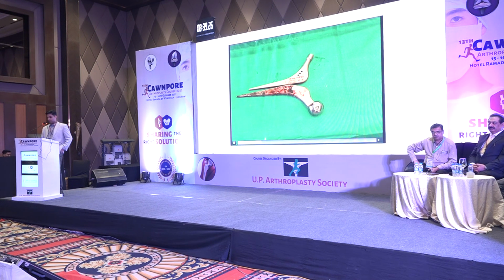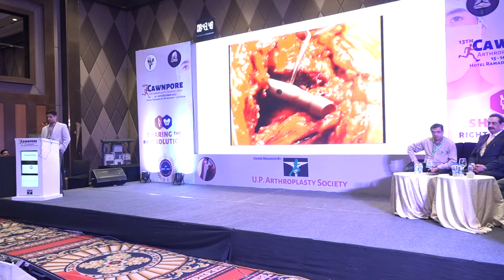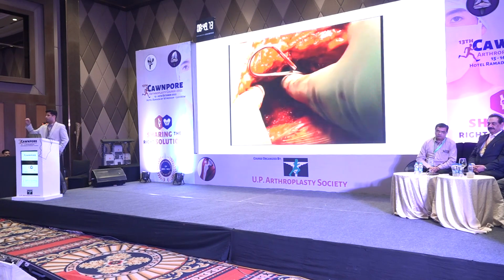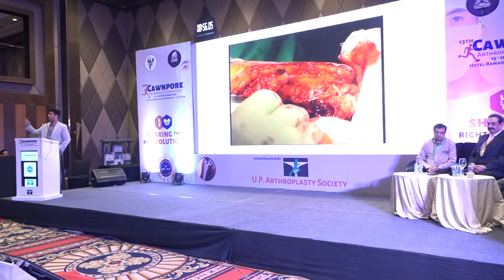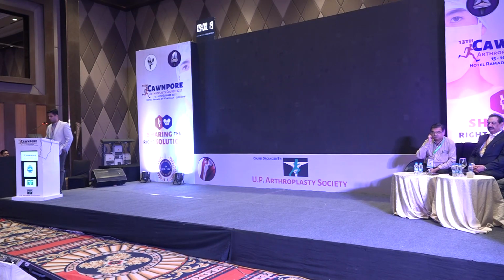And so what you're going to do is you're going to go around your prosthesis, just put a trial, push it inside first in the same space and see up to where you want to put it and do a trial reduction, because ultimately when you put in the new prosthesis, that's the level you got to go to. You don't have too many modular options to make it much longer or much shorter. So you have to be careful of where you ultimately want.